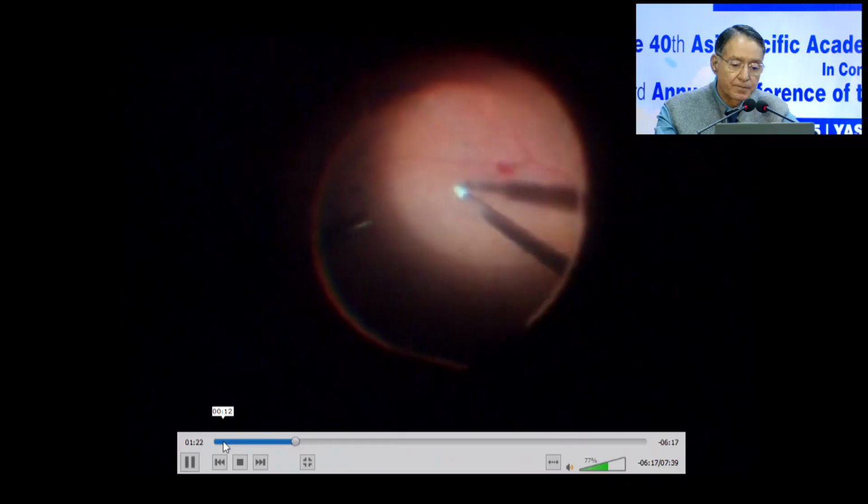This short clip shows what looks like an apparently simple induction of posterior vitreous detachment in a case of PDR. This sort of simple induction would be very uncommon. However, closer examination reveals another layer over the posterior pole, which is being removed after creating an edge.